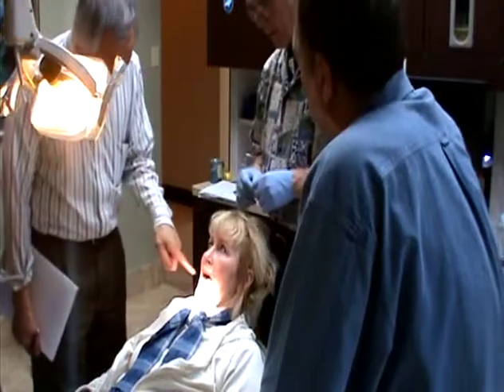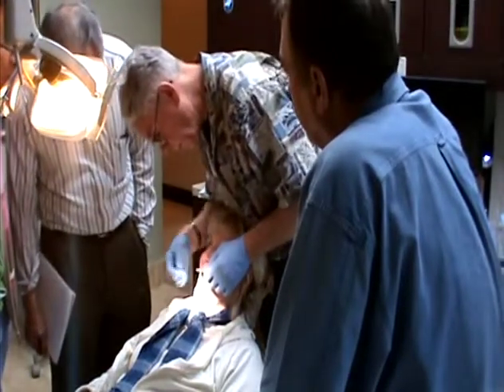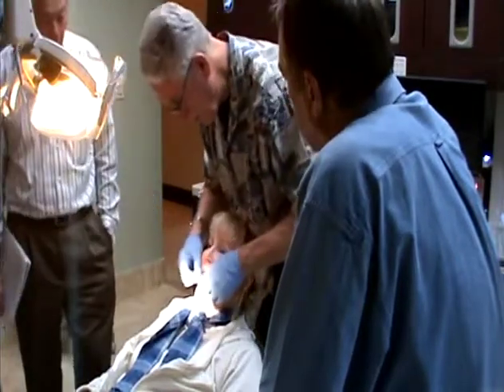But that means that she won't be able to floss in between those two premolars, right? Well, if you make it wide and flat, she could use a little super floss and floss underneath, like that.